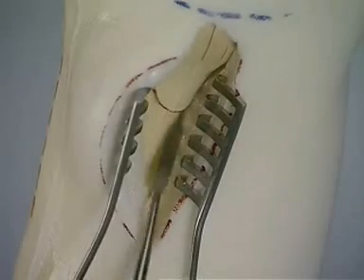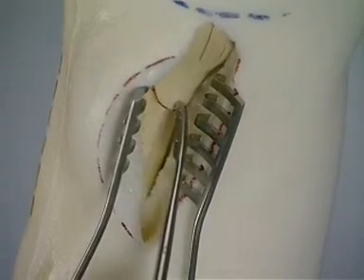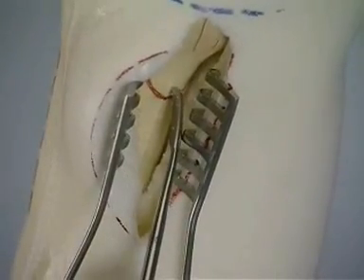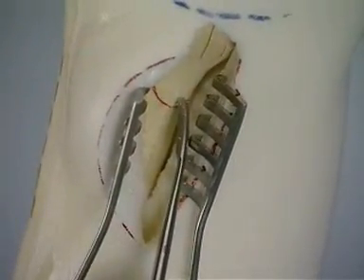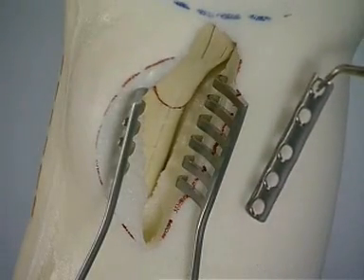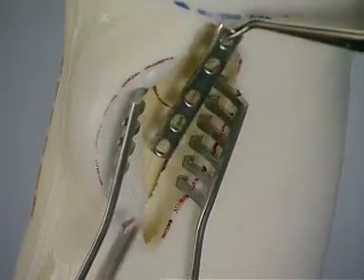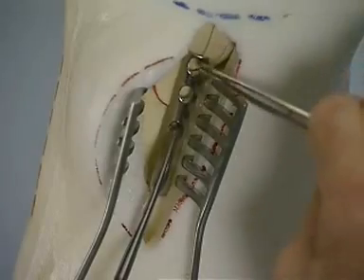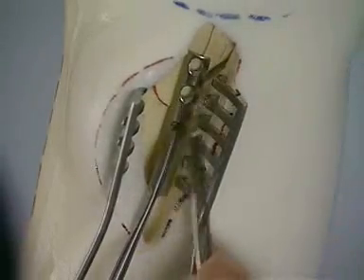After clearing the fracture gap, the reduction is achieved by pushing the medial bone block upwards. A five-hole one-third tubular plate is now positioned onto the posteromedial crest of the tibia. Only minimal plate contouring is required, if at all.